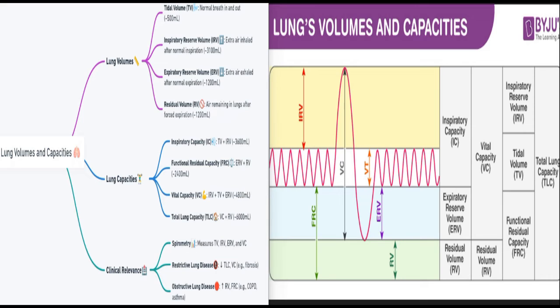But with the obstructive pulmonary pattern, you have your FEV1 FVC ratio less than the lower limit of normal, and then you have your forced vital capacity more than your lower limit of normal.